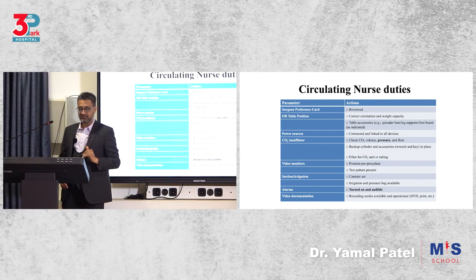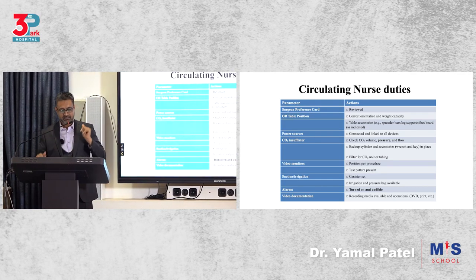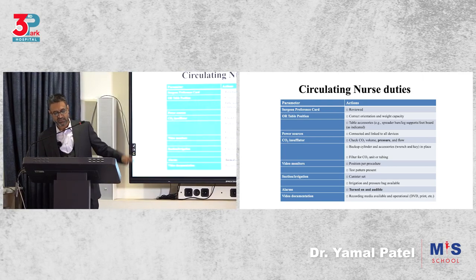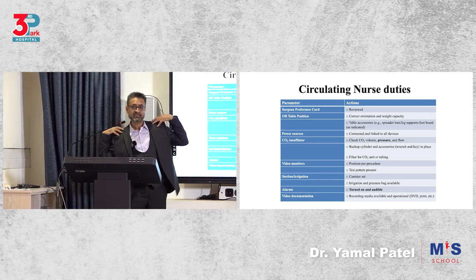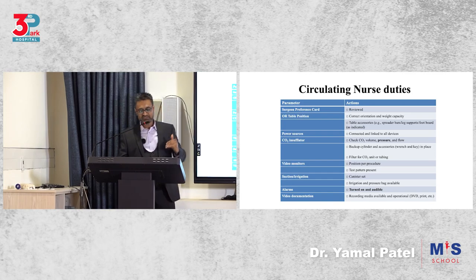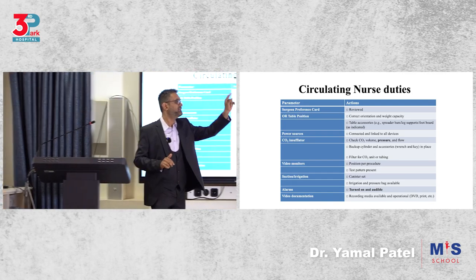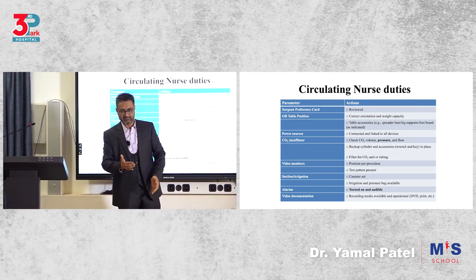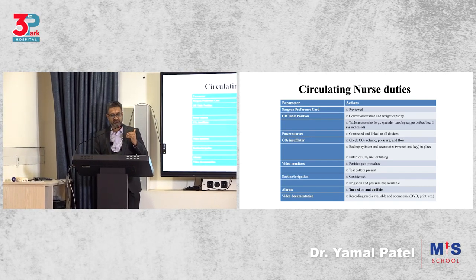Is there a surgeon preference card? Did I check what he needed? Yes, yes, tick, tick, tick, tick, tick, done. Is the OR position correct, table correct? Yes, it is flat, the height is okay, the accessories, the supports are there, the anti-slip is, you get what I'm saying? You've done everything. Then you check, is everything connected to power? Yes. Is my CO2 okay? Yes. Are the settings correct? Yes. Is it connected? Is there a backup cylinder? Yes. So that's a checklist, so that you don't get unnecessary complications and delays.